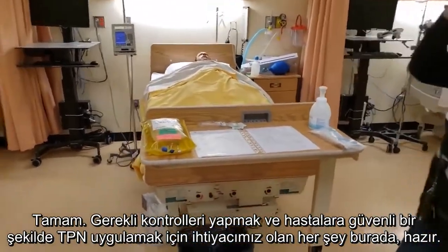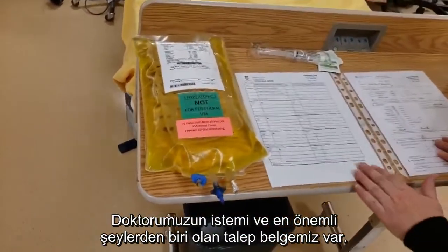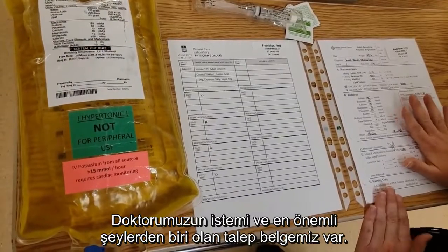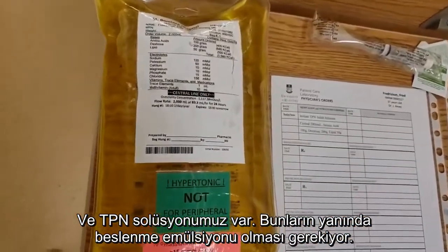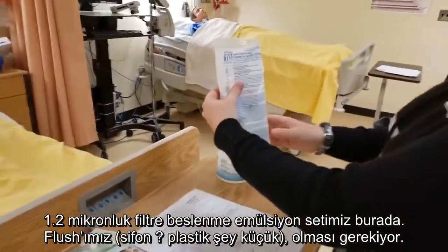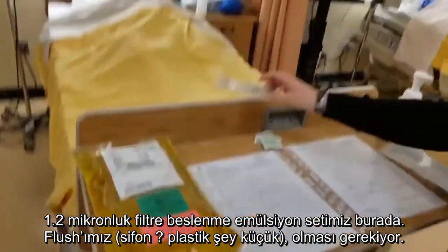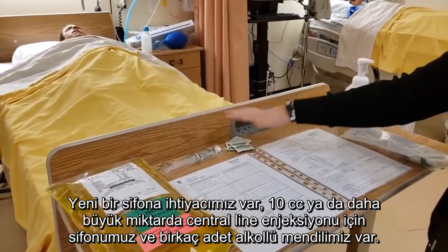We have all of the things that we need to do our checks and administer TPN to our patients safely. So we have our doctor's order. We have our adult parental nutrition requisition, which is the most important thing. And then we actually have our TPN. We also need our micro bore — our 1.2 micron filter solution set. We have to have a flush because this can only be administered through a central line, so we need a flush for our central line, 10 cc or greater, and some alcohol swabs.